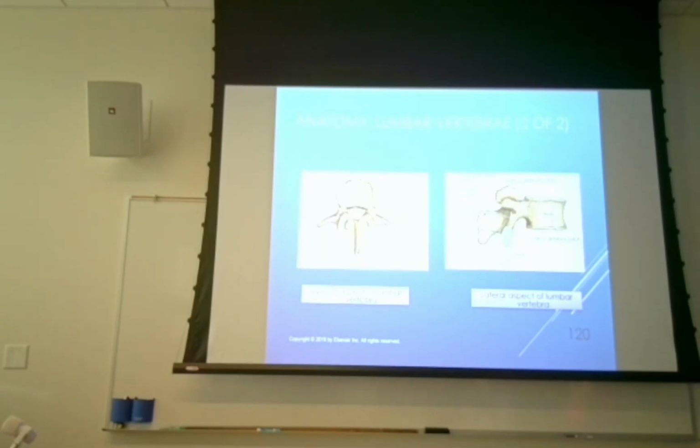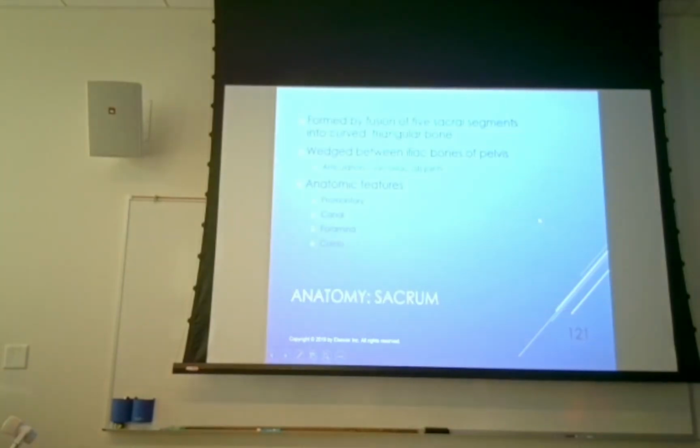Also, what you'll see sometimes at L5-S1 is, I won't say it's a natural subluxation, but it is the patient's anatomy. There is a subluxation there. It's called spondylolisthesis. And I'm not going to spell that out because I'll trip all over it, but it looks pretty bad whenever you first see it. It's really not all that significant, largely because the spinal cord ends at L1. Now, you still have nerves that go down through the spinal canal and exit at different places, but the spinal cord itself is already done at the cauda equina around L1. All right, so it looks pretty awful, but it's not as bad as what it appears to be.